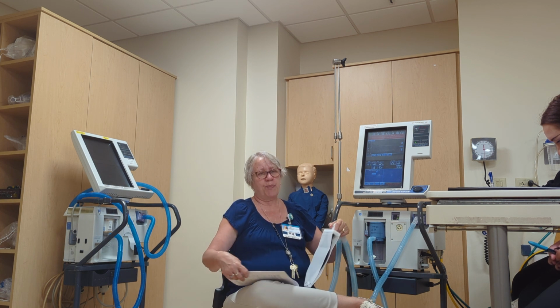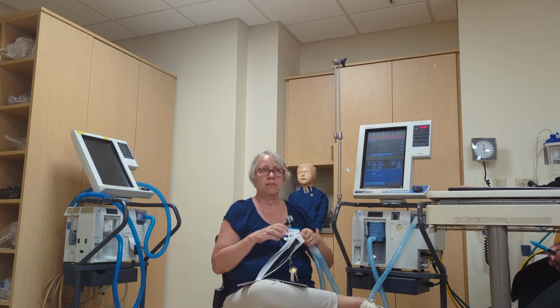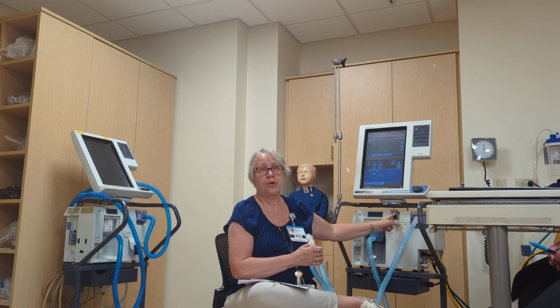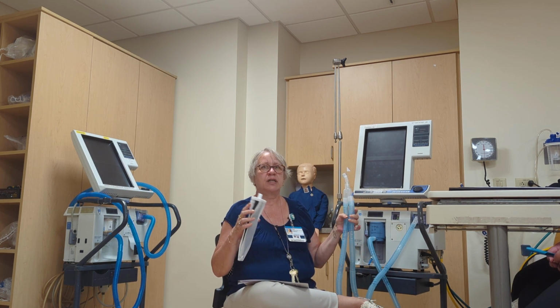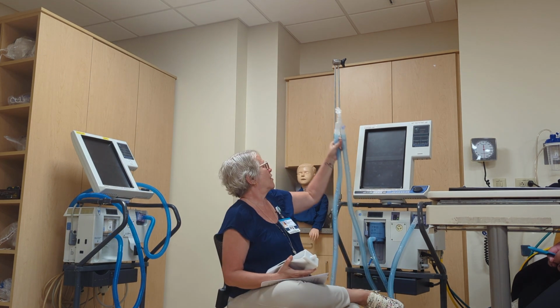When you're gonna turn your ventilator off, you always take your patient off first, and then you turn it off. That's a huge pet peeve of mine. You've got to take your patient off before you turn your vent off. It's safety.